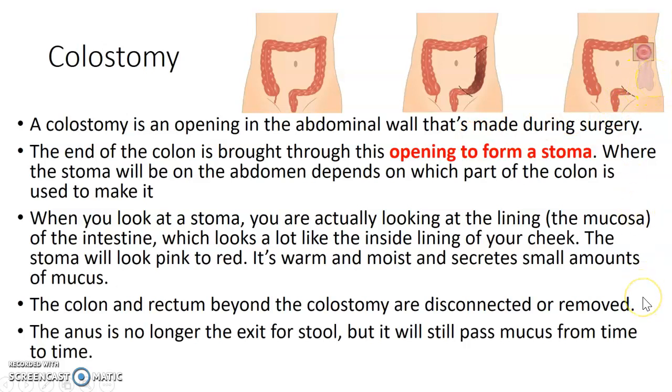Sometimes we'll do an enema through this ostomy. They remove the bag, the tip goes right through there, and contrast is run through to check everything, and then they can be reattached. And that is the end of that.